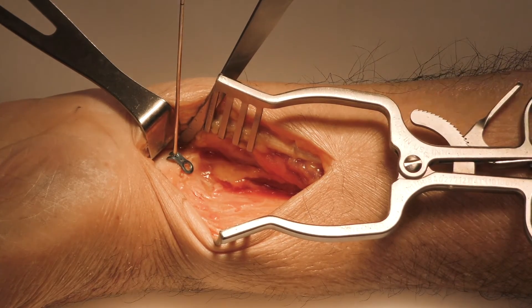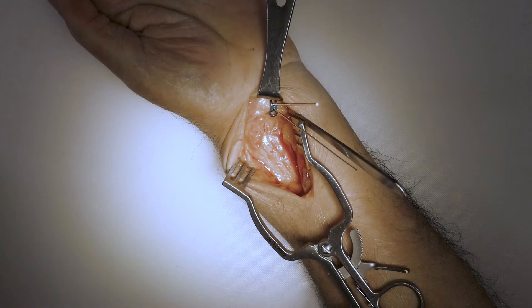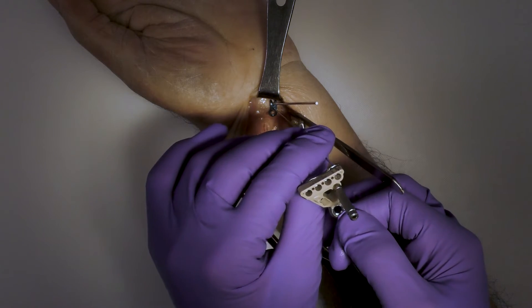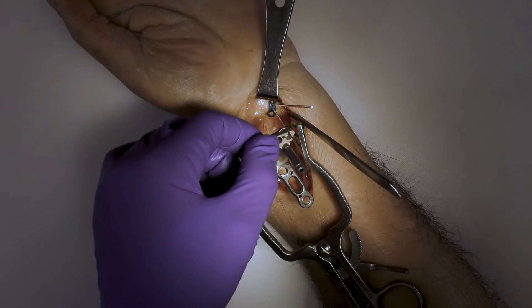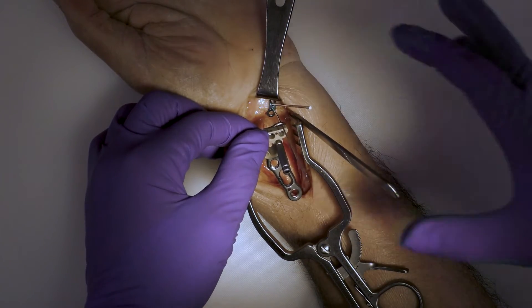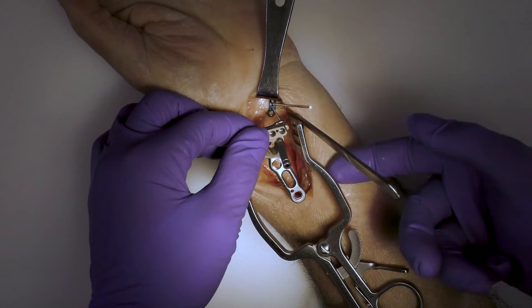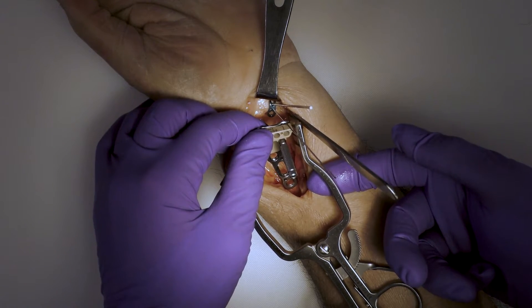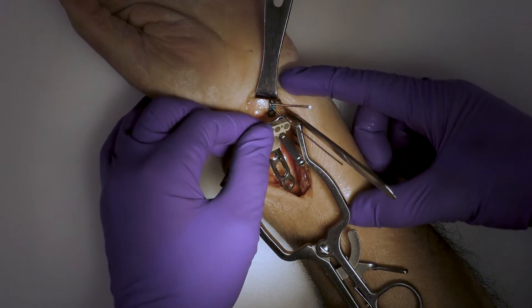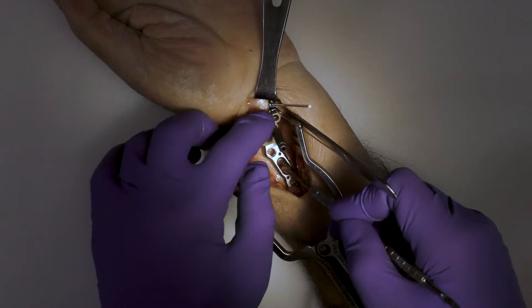From here, drill a 0.035 K-wire through the avulsion hook plate to provisionally fix it to bone. At this point you can place the 0.035 K-wire through the most distal holes in your AccuLock 2 distal radius plate. This may require your surgeon to extend the incision more proximally. A lot of people like to make a small volar incision, but if you want to utilize this 0.035 K-wire to position your plate and the incision is too far distal, it is difficult to fit the distal radius plate underneath all those soft tissues. At this point, if the incision is too small, extend it more proximally so that you can position the plate without fighting the soft tissues and adding another variation of difficulty to an already difficult fracture pattern.